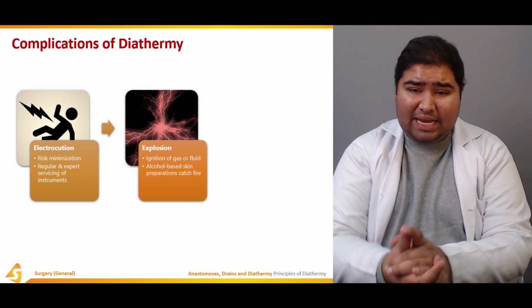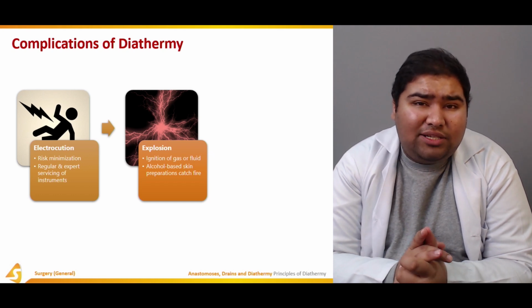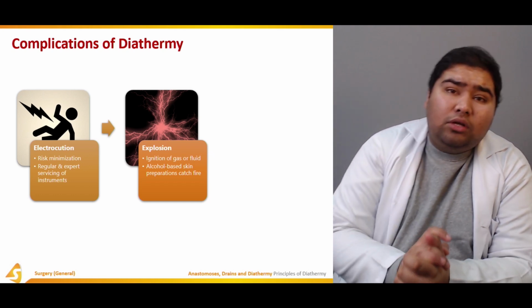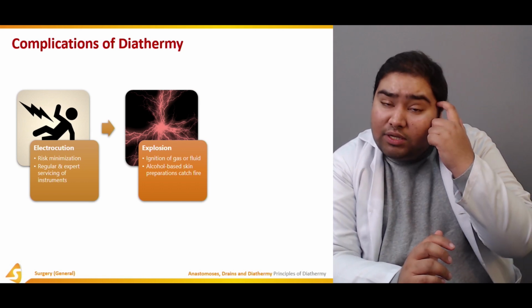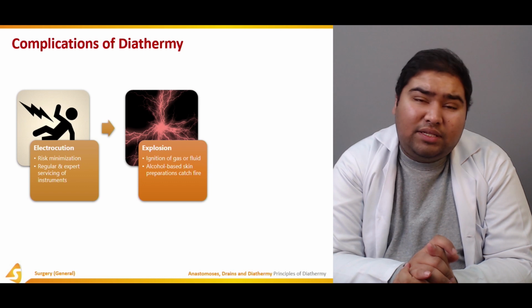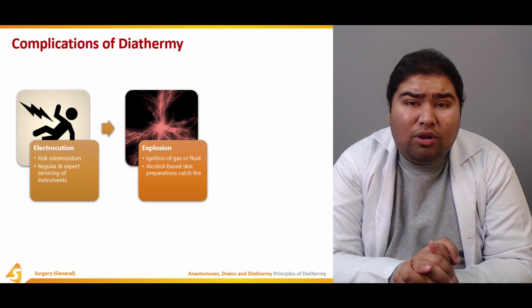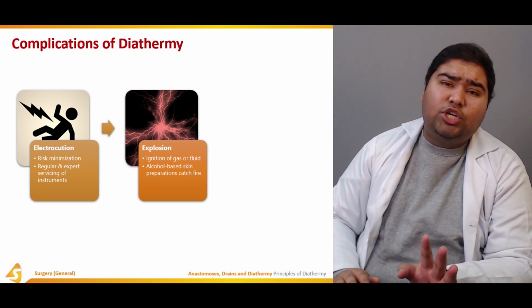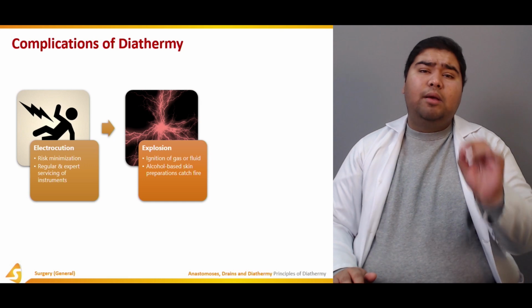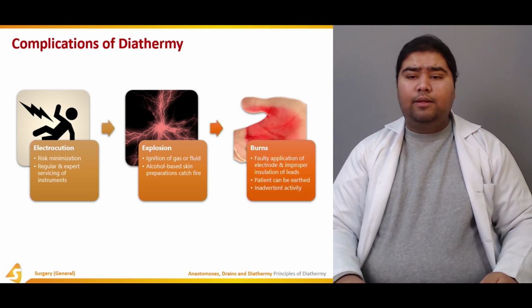Now, explosions can occur. Explosions can occur by ignition of a gas or fluid. Now, alcohol-based skin preparations are usually avoided because these can catch fire in the presence of diathermy. So whenever you have to use an alcohol-based skin preparation, it's best if you don't use it. However, if you're using it, make sure you are not performing diathermy anywhere near it.